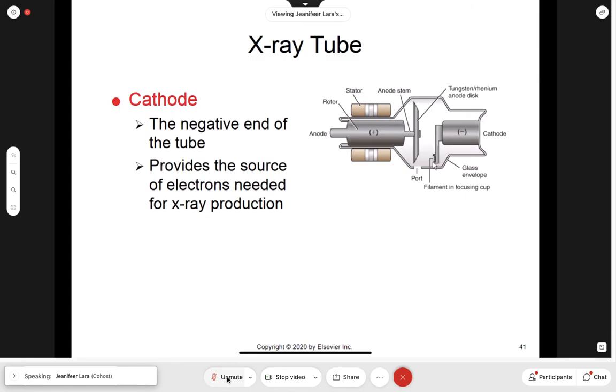Got it? Perfect. What's a vacuum tube? When I say that, what does a vacuum tube mean, and why is that important here, now that we've learned what is happening inside of the X-ray tube? What's inside of the vacuum tube? Is there the presence of air? Yes, so it's good, no air. It moves the electrons, but they don't collide with the other electrons.